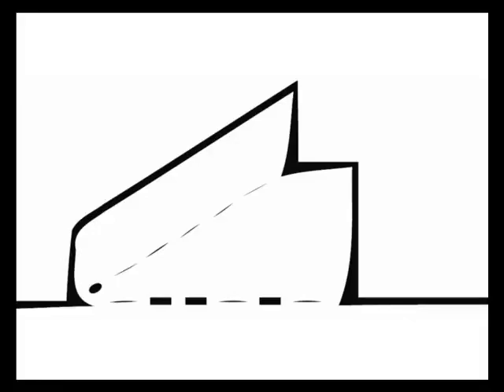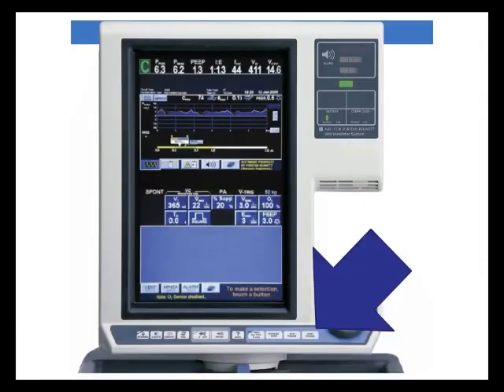So if your peak pressure means nothing, what does mean something? Well, your plateau pressure, just like in the lung injury patient. So what you have to do is that same inspiratory hold we talked about in the last lecture. You have to have your respiratory therapist teach you how to get a plateau pressure on your ventilator, and you have to measure it. And if the plateau pressure is less than 30, then they don't have significantly worrisome AutoPEEP. If it's greater than 30, in these patients, the only reason for that is AutoPEEP, and you need to go down on the respiratory rate.